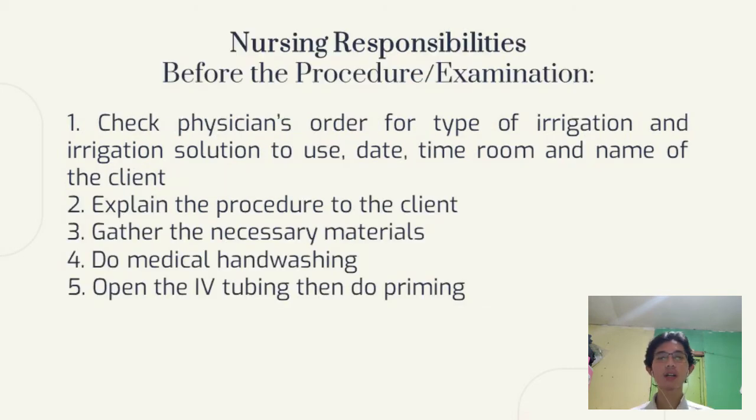Next, we move on to the nursing responsibilities. Before the procedure or examination, first is to check the physician's order for the type of irrigation and irrigation solution to use, date, time, room, and name of the client. Next is to explain the procedure to the client. A third is to gather the necessary materials. Next is to do medical hand washing.